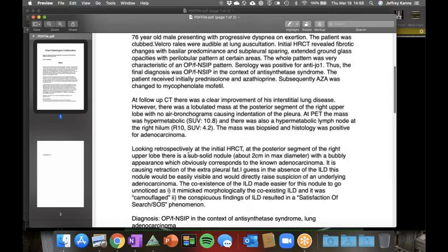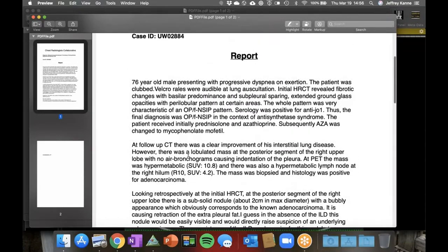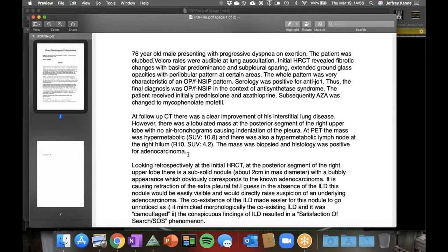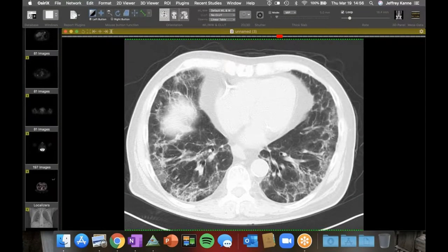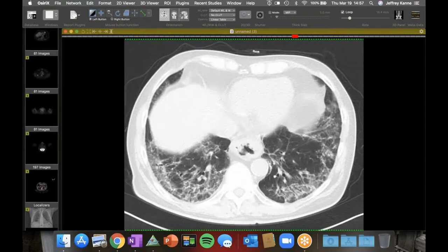Yeah, the detection of adenocarcinomas in fibrotic lung is really hard. Yeah, especially when they're small. I mean, usually the ones I've seen, sometimes if you have old imaging, you can go back and see where they started from. But I find it harder with more UIP type cases where you have a lot more collapse and volume loss than you do in some of the NSIP cases. Also probably because it's more common.